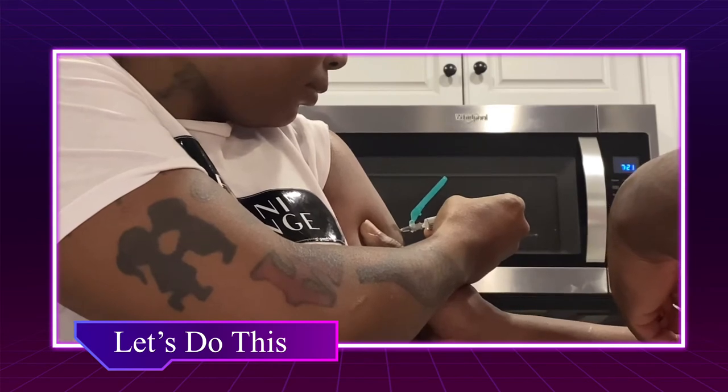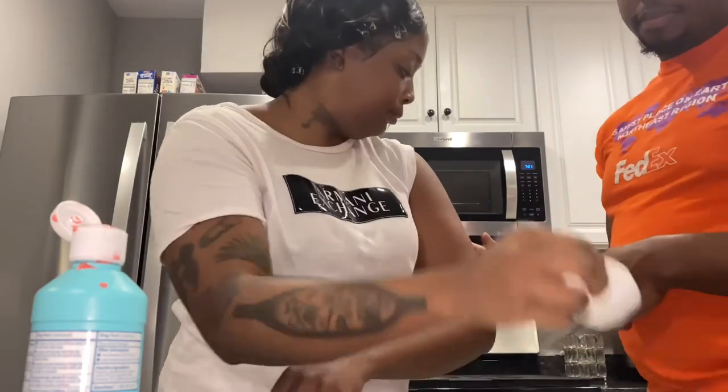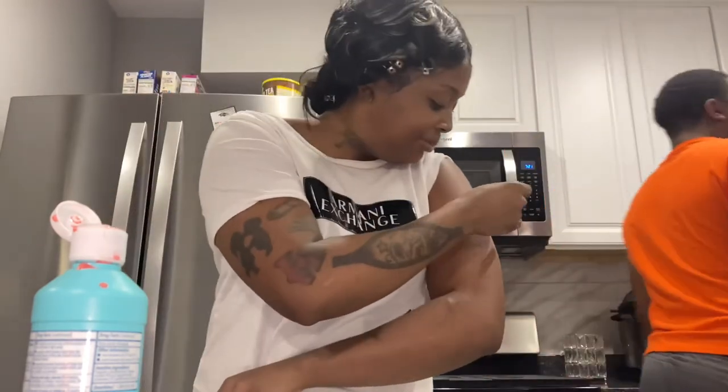When I was putting the medicine in, I was going slow too, because I've been getting the Depo shot for so long that I tried to mimic what they do at the doctor's office. Then I put the little cap back on the needle to protect it so nobody gets stuck.